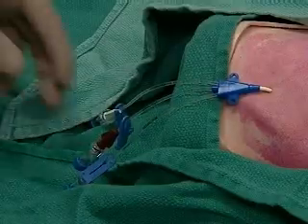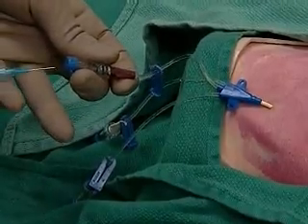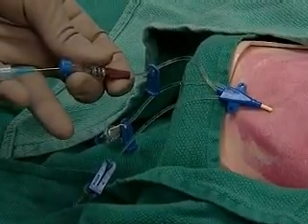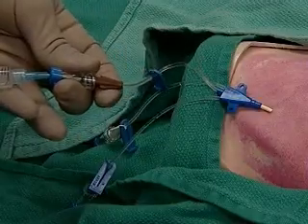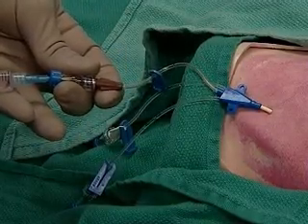Now an important check. Put a syringe containing saline in the hub, and make sure you can both withdraw and infuse fluids. You'll check all hubs in this way before suturing and applying a sterile dressing.